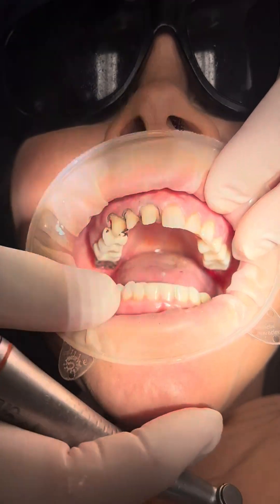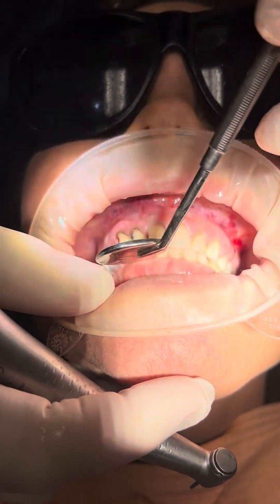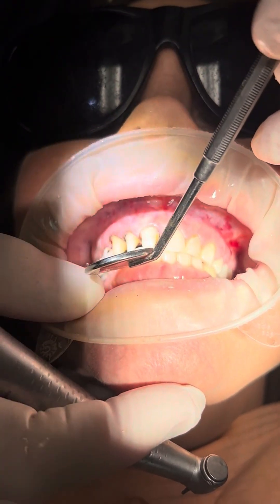Bite your teeth together for me and we're checking for clearance. We've got good clearance. We need at least one and a half to two millimeters there and we have that.